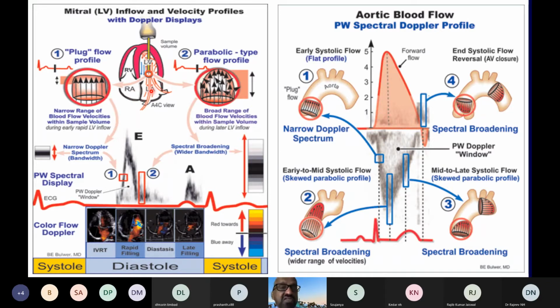Suppose we say 6 to 12 millimeters left atrial pressure, right atrial pressure is about 2 to 4 millimeters less. It will be 4 to 8 millimeters. So this is a low velocity flow, and for this you have to use pulse wave Doppler and actually reduce the color gain to be able to look at the left to right shunting across the atrial septal defect.